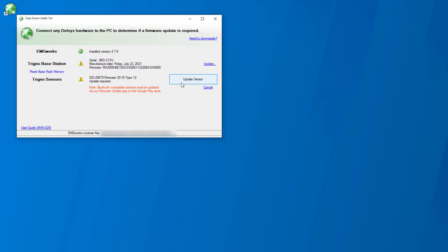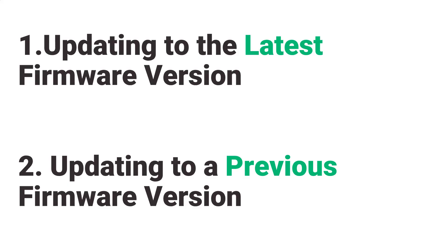Once the sensor is paired, the tool will list the current firmware version. Yellow triangles indicate that the software and firmware are not on the latest versions. This does not mean updates are required. If the current sensor firmware does not match the intended version, please proceed to the appropriate update process.